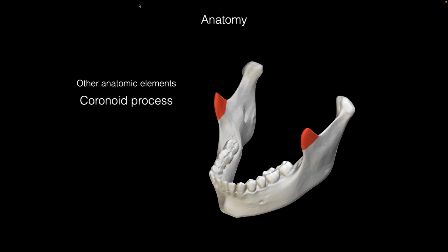The coronoid process comes downward and forward, I'm sorry. They come downward and forward, and the coronoid process comes with the condyle. It comes forward and downward. And if the denture's in the way, it's going to knock the denture off. Patient comes and says, oh, the denture is fantastic, but when I yawn or if I open my mouth too much, it falls down. That's why the coronoid process is knocking it off.